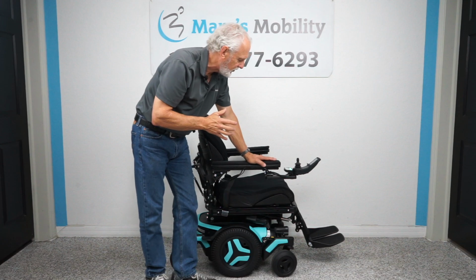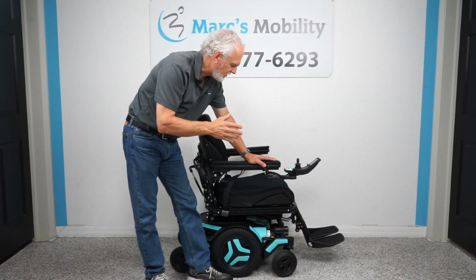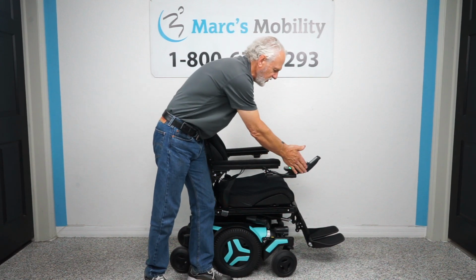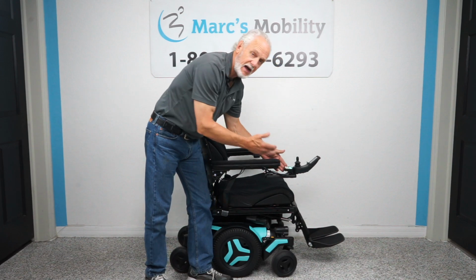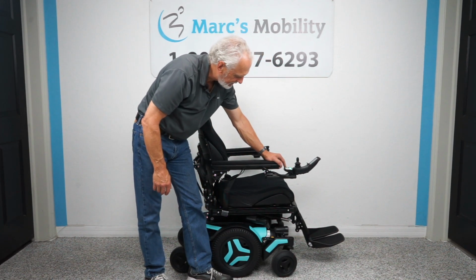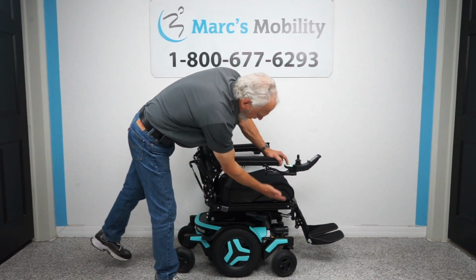But the first thing we'll do is show you the features, the seat lift and all that. So to make the seat go up, tilt, and all that kind of good stuff, you can do it through the joystick or through the switch box. I like to use the switch box, it's quicker for me. So if I hold the first button down on the switch box, you'll see the seat lift start going up. So you'll see the seat going up.